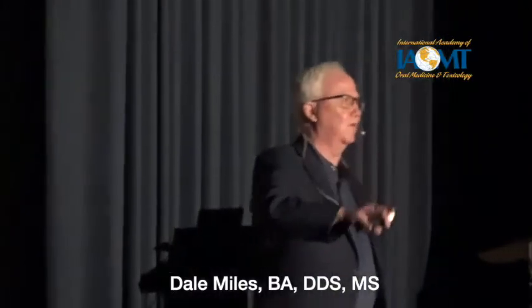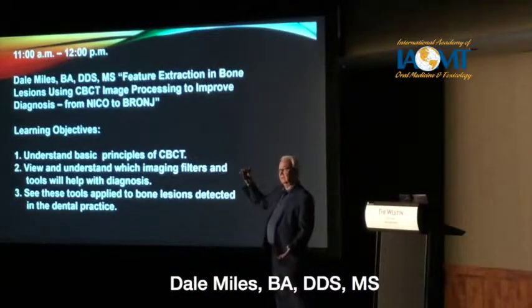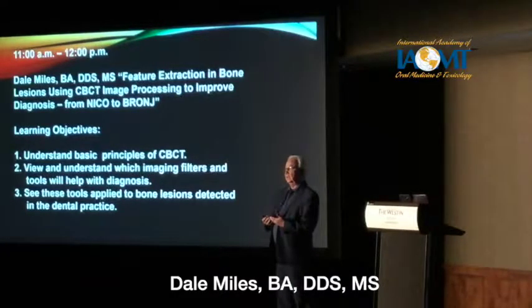All right, he showed some interesting images, and I have some questions for him, but Hounsfield units do not relate to intraoral or panoramic images. They are actually CT values from -1,000 to +1,000, with +1,000 being bone. And maybe there's a correlation in the software that Cavo or whoever sold him the machine made.